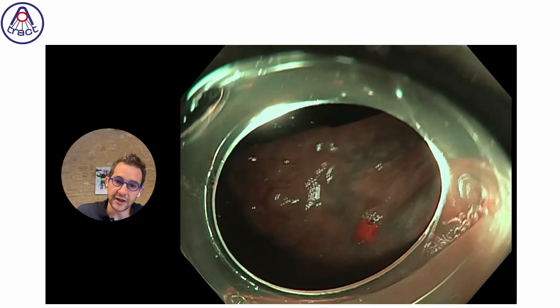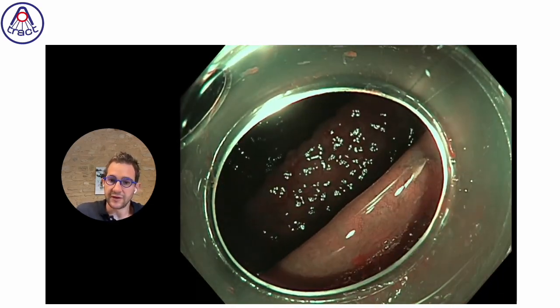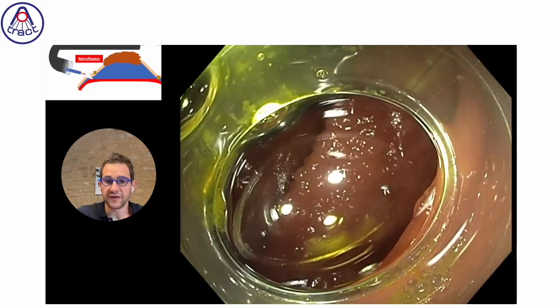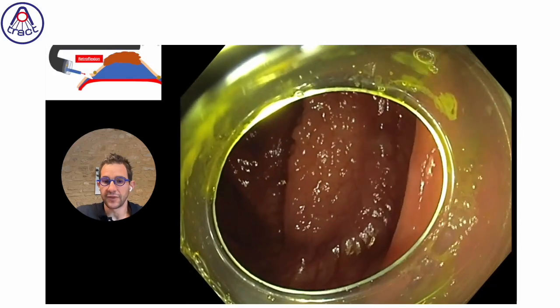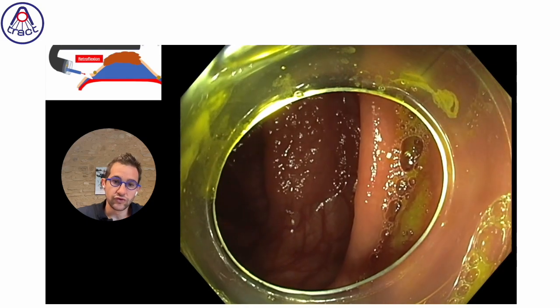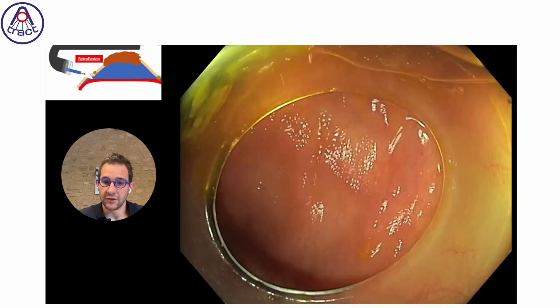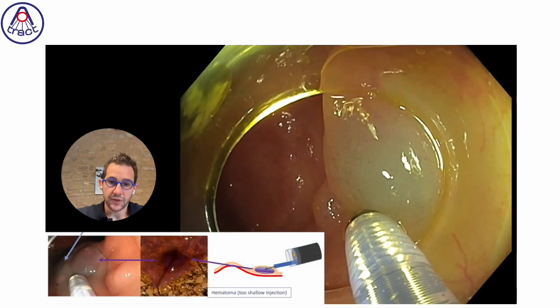To see it completely and to be sure there is no malignancy in it, no demarcated area of malignancy in any areas, you should do both direct approach and retroflexion to see the lesion and explore. In this case, it seems more difficult to do the oral incision by the direct approach. So first, for me, the strategy is to do the oral side first after injection.